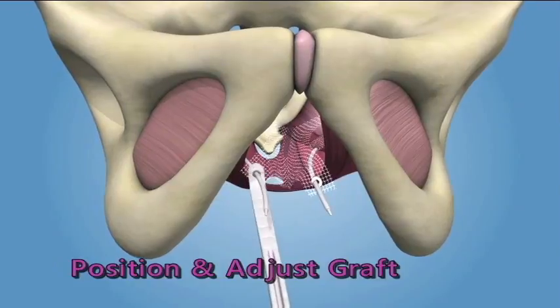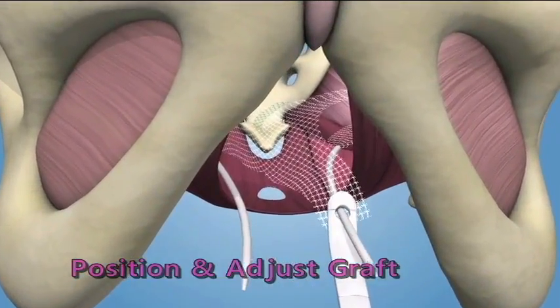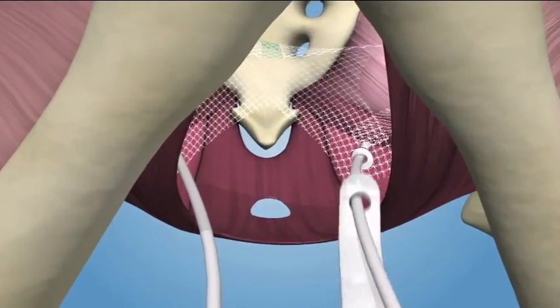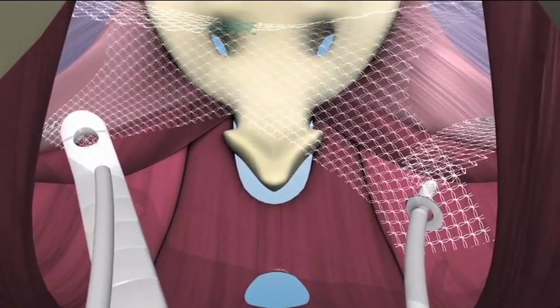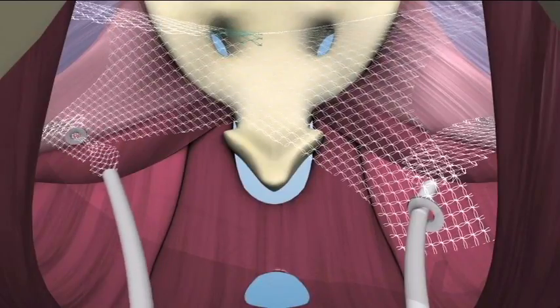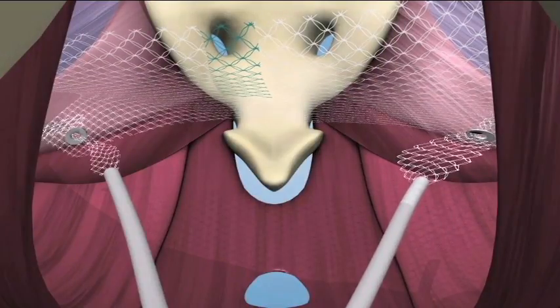Position and Adjust Graft. To position the graft, insert the end of either fixation arm through the tip of the adjustment tool. Hold the apical fixation arm medially within the introitus and slide the adjustment tool down the apical fixation arm toward the graft, pushing into the pelvic cavity. Slide the graft body down the apical fixation arms until the desired position is obtained.